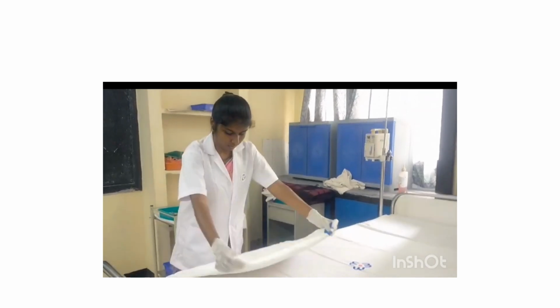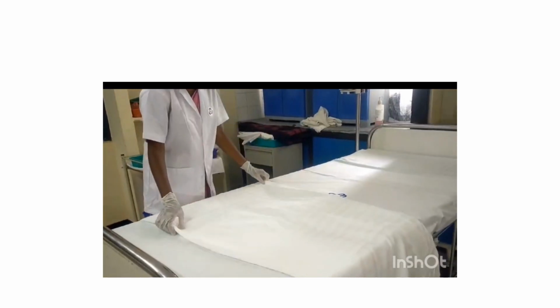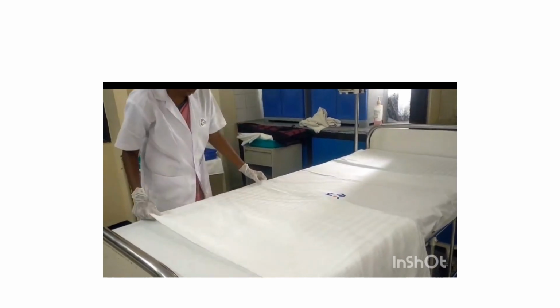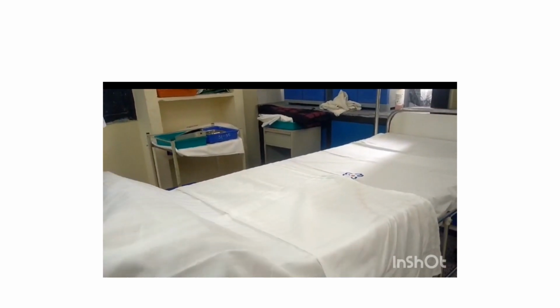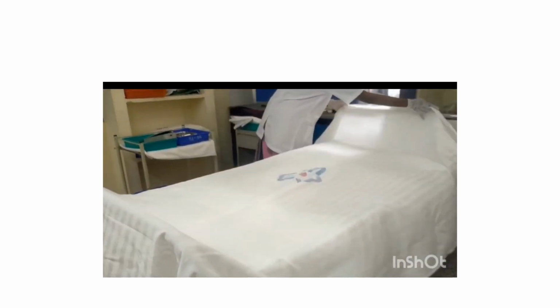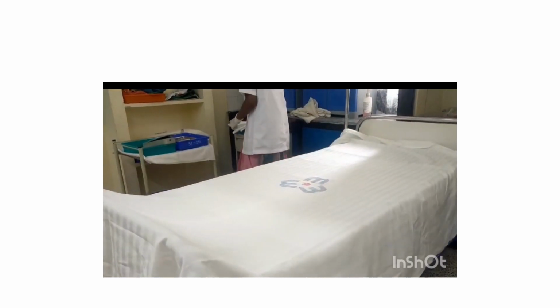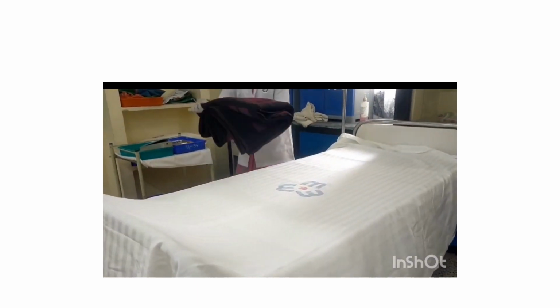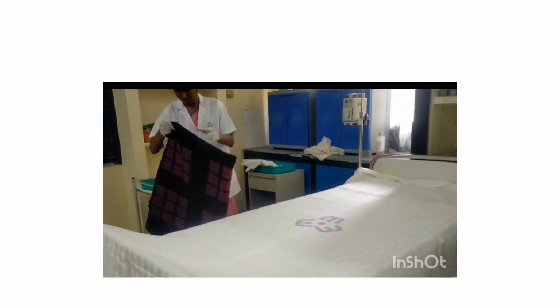Okay, so the post-operative bed. In a post-operative bed, we must prepare the bed as for an open bed. Now spread the top sheet. No need to tuck the top sheet at the foot end. Just spread it over the mattress above the draw sheet. And now place the blanket above the top sheet.